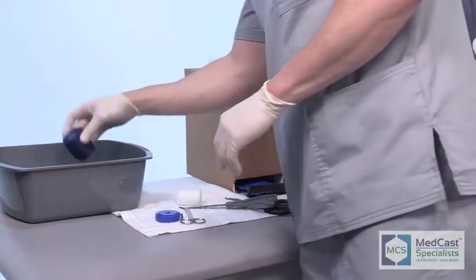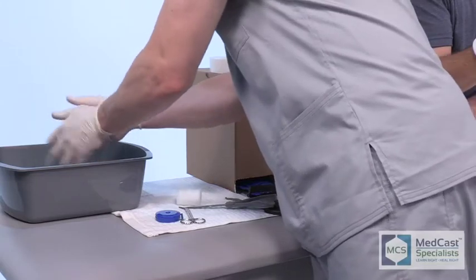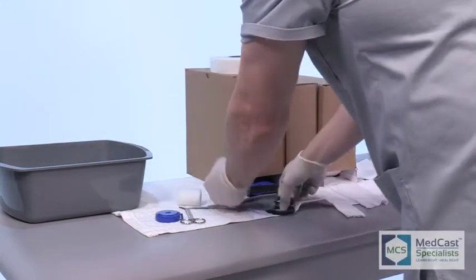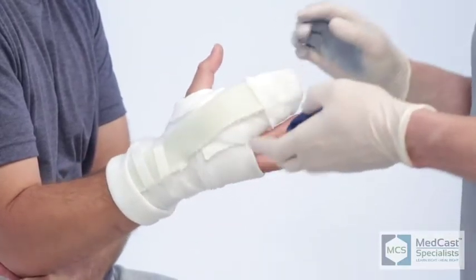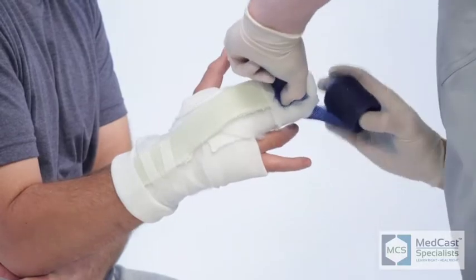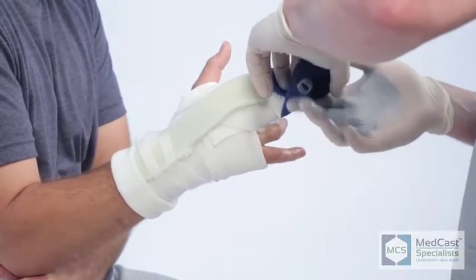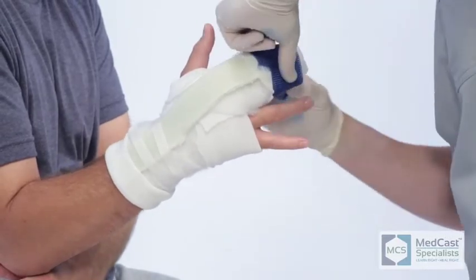Don't submerge it completely in the water and drown it. Just lightly get it wet. Make sure you use cold water as well. This takes a little bit longer to wrap, so using cold water will give you more time. For this one, I'm starting distally, working my way proximally. Sometimes it's a lot easier to start at the digits and work your way back.